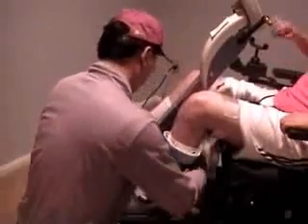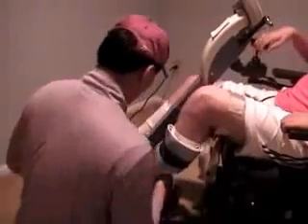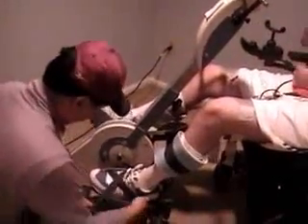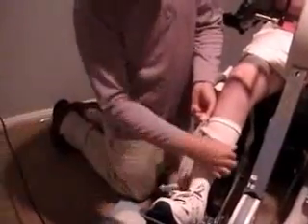I take off the legs of my wheelchair and wheel up to the bicycle, and then my caregiver will take my legs and strap them into the leg plates. If you do have a leg bag, you can just take off the strap and place it on the side so that it rests comfortably.